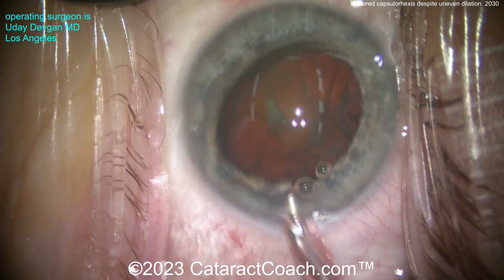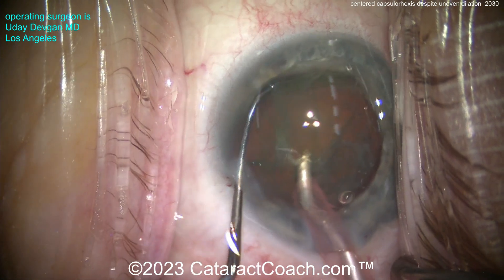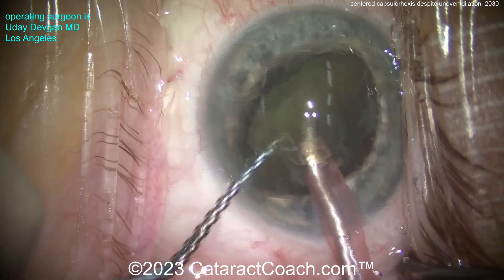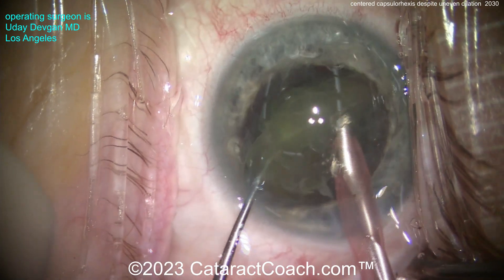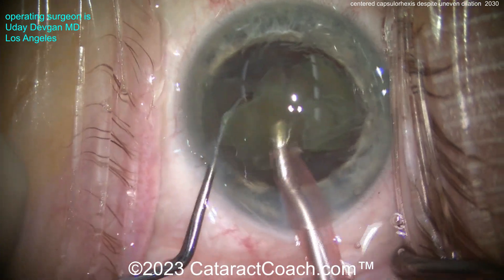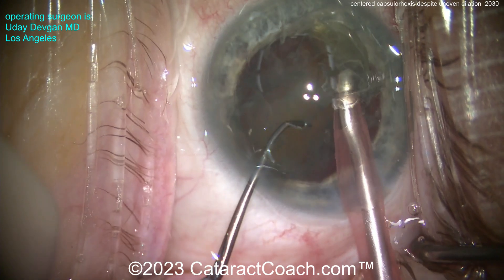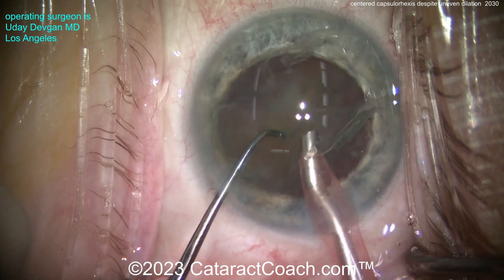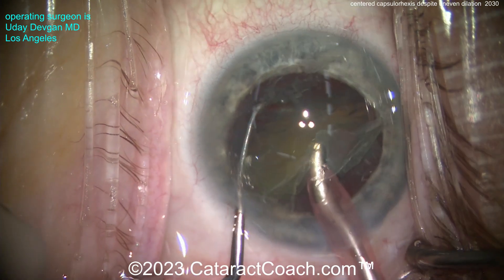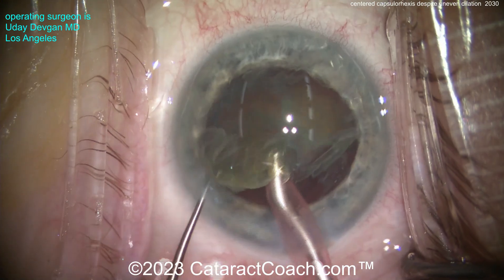Beveled down — you know that's what I like, but you can do it any way you feel. Here's the chopper in, buzzing over the phaco probe. Chopper goes around the lens and there's two halves, just like that. Let's emulsify down the first half. I am using phaco power modulations to minimize the total amount of ultrasonic energy placed inside the eye — that's burst mode or pulse mode — and you want to use a variable duty cycle, less than 50% duty cycle for those pulses. Here comes the second half; chopper going around it, we can chop it again, and there's two quarters. Each of these can be taken down pretty easily.